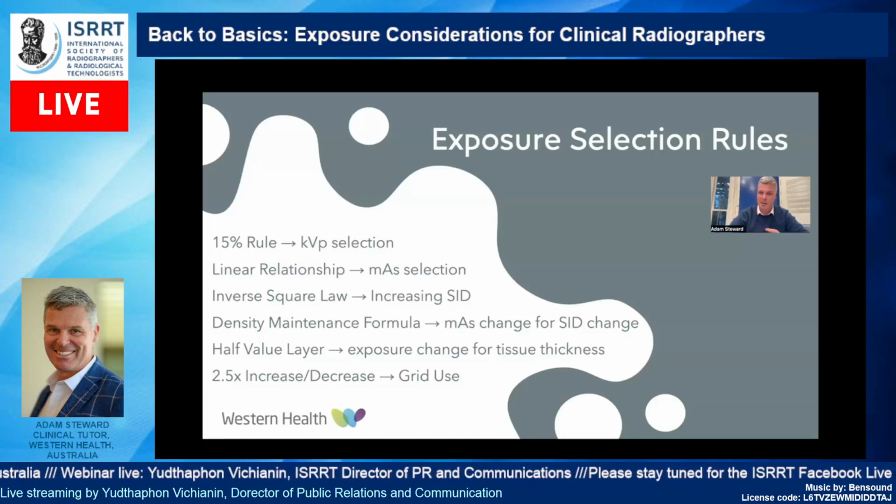Okay, and again, you've got the grid use. When you're using a grid, you're going to have to at least double it. You're going to double it for a lower ratio grid, like a 6 or 8 to 1.